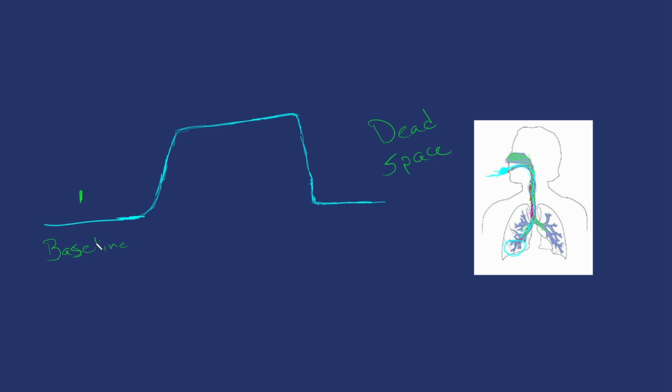Eventually we get to that expiration. So we're starting to breathe out, and again, we have that trickle, so it takes a little bit. There is that lag effect. Eventually it mixes up nice enough that it can come up, and we start detecting it here towards the mouth where we're reading this from. And this is going to be our stage 2, or our expiratory upstroke. Expiratory upstroke. Okay, and that's when the level of CO2, since our lungs are excreting the CO2, that level being detected now at our capnography meter is going to start going up.